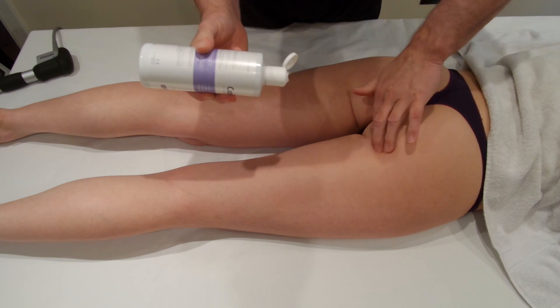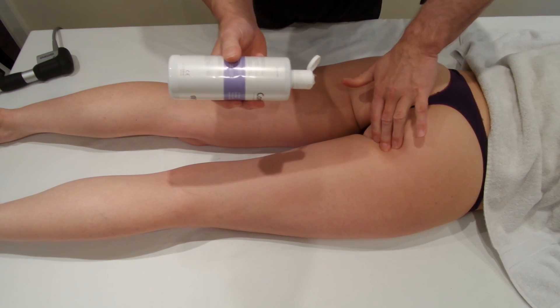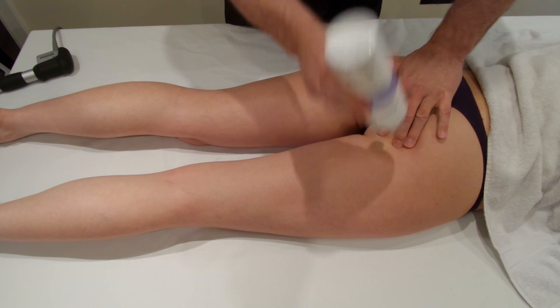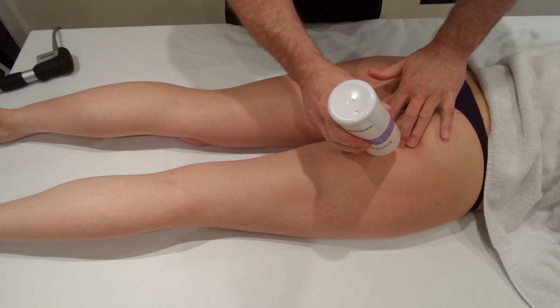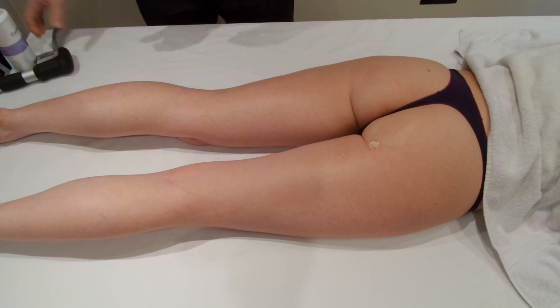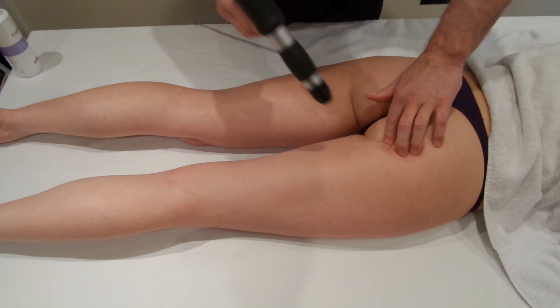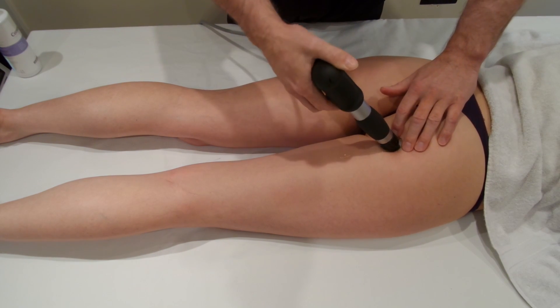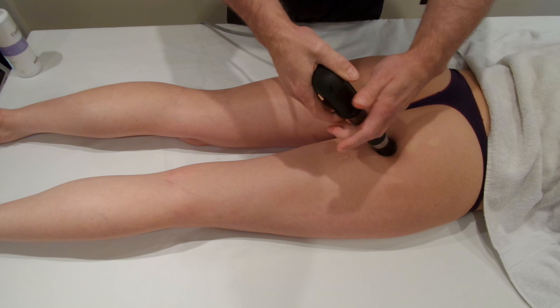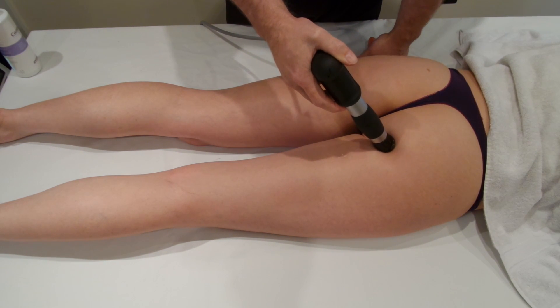We're going to put some gel onto the area, but we actually need to find the origin of the hamstrings — the ischial tuberosity — and put the gel onto the area. Then we're going to come on with the 15 millimeter focused head. Just use your finger to find the actual origin and then put the head onto the origin.